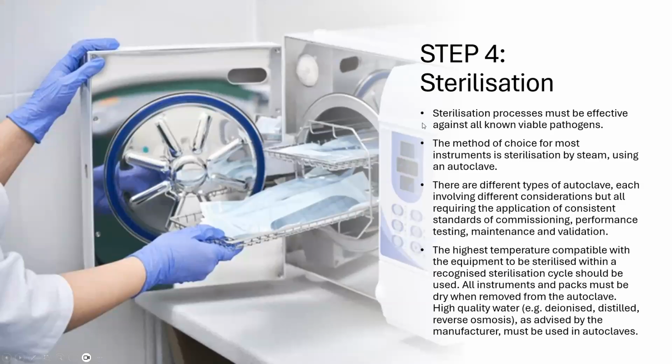Step 4, now the sterilization. Sterilization processes must be effective against all known viable pathogens. The method of choice for most instruments is sterilization by steam using an autoclave.